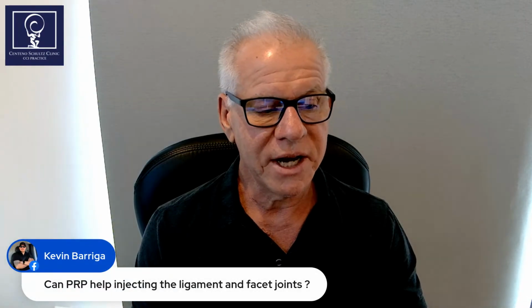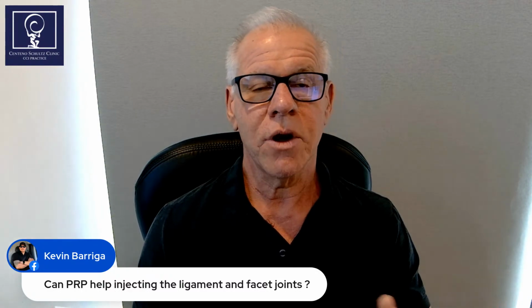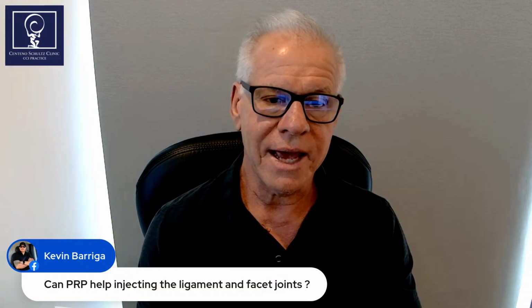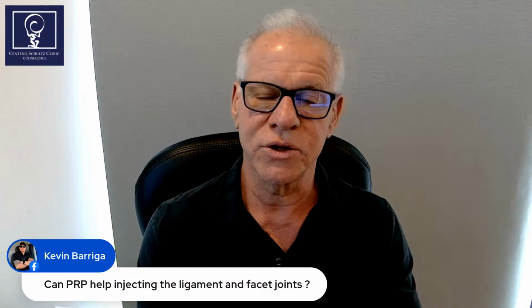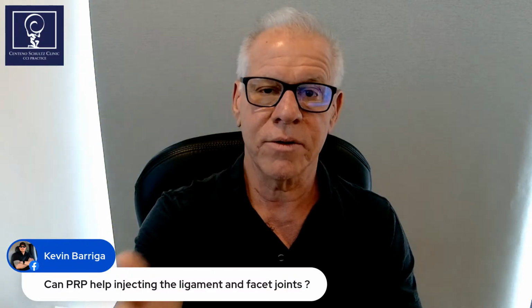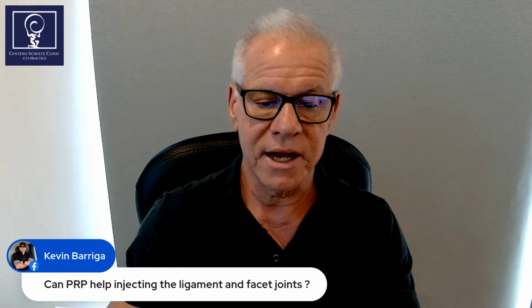Kevin asks: Can PRP help injecting ligament and facet joints? You know, Kevin, it can. The biggest thing to focus on there is if you're going to inject the facet joints, you really need fluoroscopy with contrast confirmation. You can do it under ultrasound. I just can't do it well and consistently under ultrasound because you can't make sure that you're in the joint. So my recommendation would be, if you're going to get PRP injected in the ligaments, that's something that can be done under ultrasound. If you want it in the joints, it's got to be ultrasound plus fluoroscopy with contrast. And the answer is yes, it can be injected in both places.